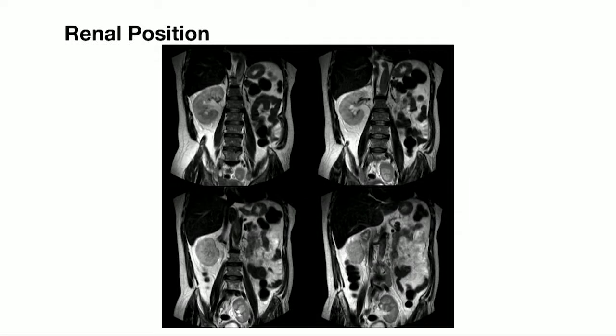As I say, we need to know where the kidneys are. Someone in this room might have a kidney lurking down here in the pelvis and they don't even know about it, okay? Because the kidneys start down in the pelvis and migrate up the back of the abdomen, so they're not always where you expect them to be. So we need a large field of view that includes the pelvis.